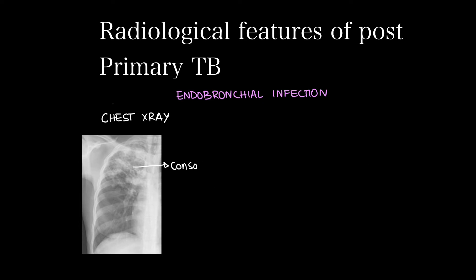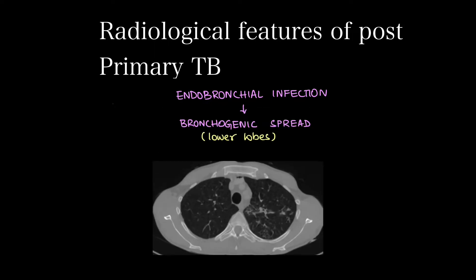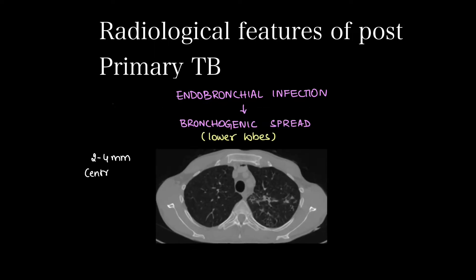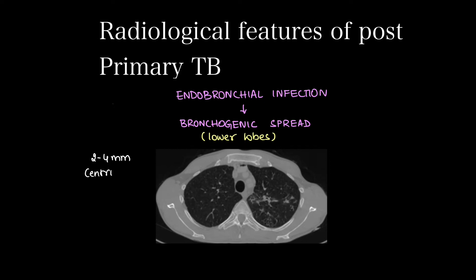The endobronchial infection can spread to other lobes and segments — this is known as bronchogenic spread of infection, more commonly seen in lower lobes. There can be 2–4 mm centrolobular nodules which classically show endobronchial spread or tree-in-bud appearance. This can be seen in various infections which show endobronchial spread.